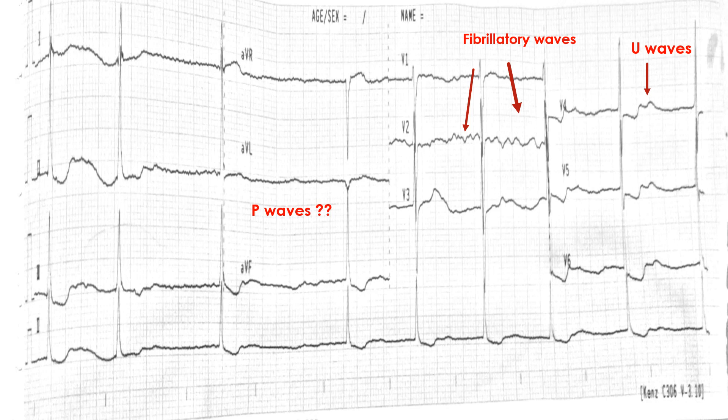One thing that is pertinent to mention is the presence of U waves, although they are pretty hard to identify. There are some reasons that can be associated with the presence of U waves, which we will discuss further. Always try to dig out all the findings available on the ECG. So far we have identified atrial fibrillation and the presence of U waves.